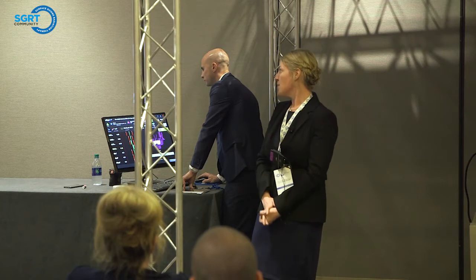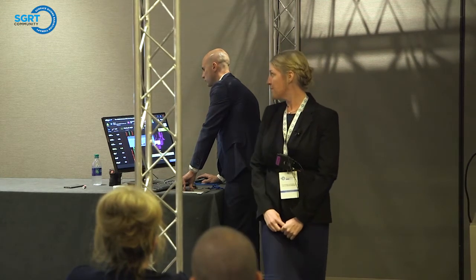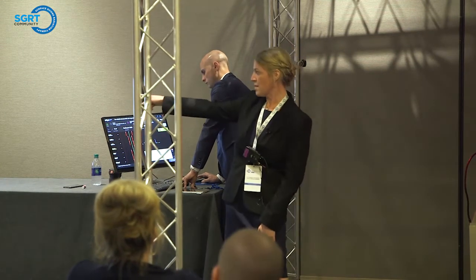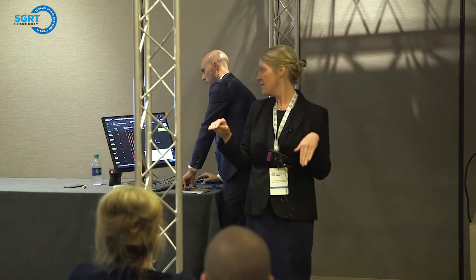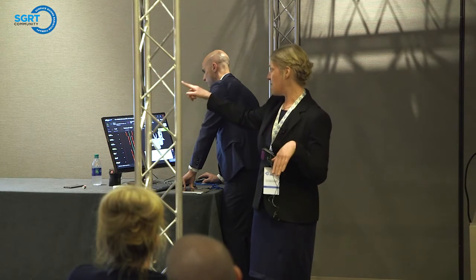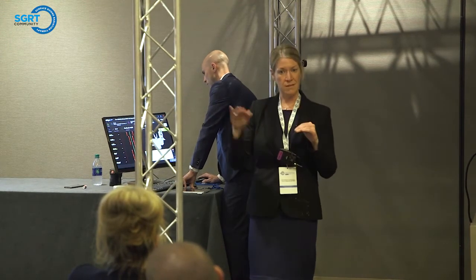So there's a gated capture checkbox, and you would select reference. And when you do that, the system will acquire, you can see in the lower left corner, 30 reference images right at the level of the isocenter. So then when your trace comes at the bottom, I'll see 30 images, and these are all references in one breathing cycle.